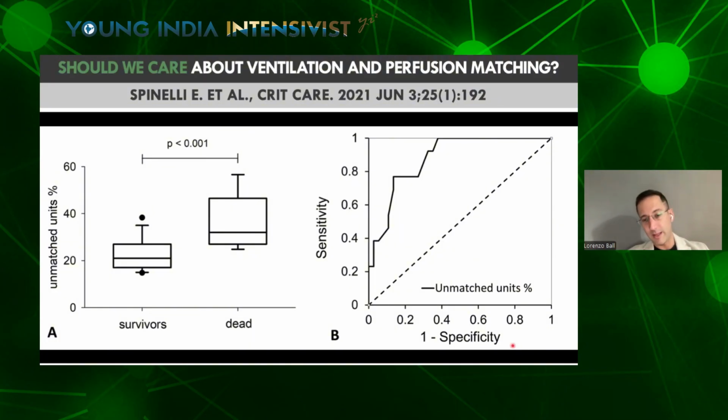The only real bedside tool we have is electrical impedance tomography. But as I mentioned before, the option of measuring also the perfusion is more recent. Not all machines have it, and probably from a technical standpoint, we still have to understand a little bit more. I don't want to spend too much time.